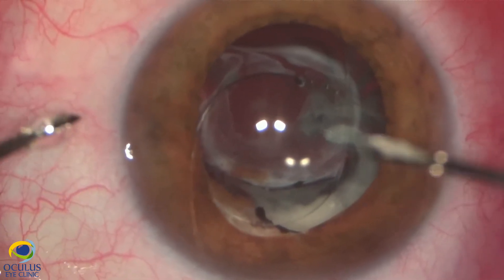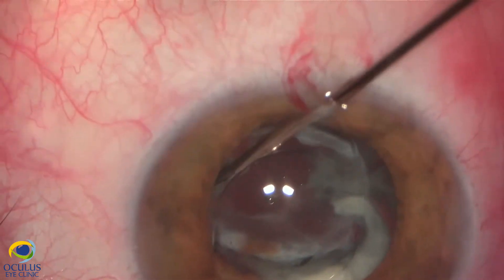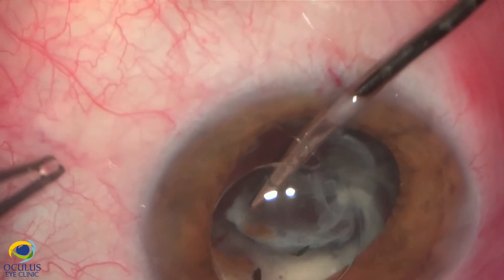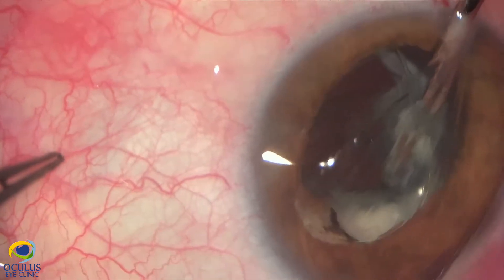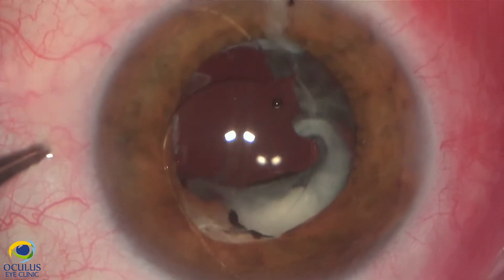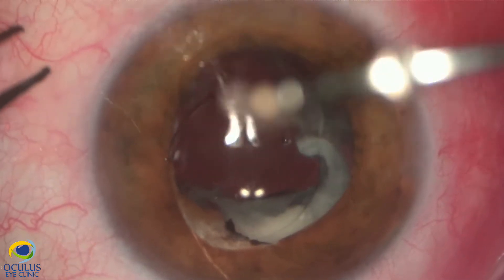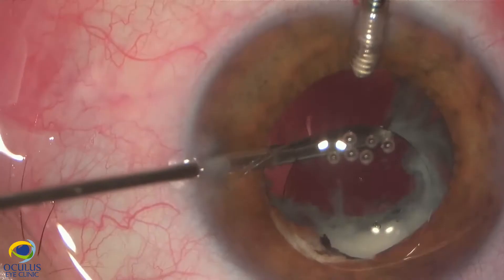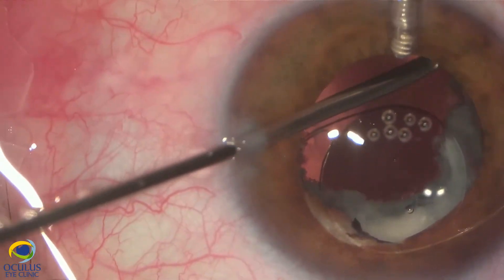We continued with the cutting of the whole anterior and posterior capsule which were stuck together, and then continued with the vitrectomy and aspiration of the thick cortex remaining in the periphery of the former bag.